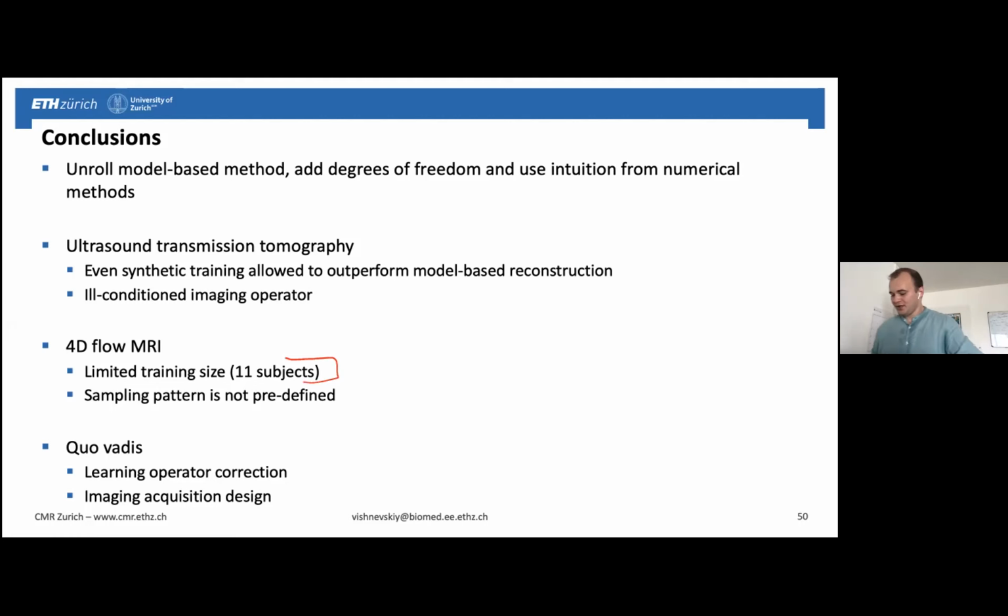And the outlook is that, from my perspective, most of the reconstruction methods are already at the limit of the amount of information that we can extract from the signal. A lot of papers report improvements of 15 or 20% in reconstruction accuracy, but unfortunately, most of those improvements are shown in synthetic experiments. They can change the data, so they divide the test and training datasets. But what is more important here is the synthesis model, so how we simulate the synthetic measurements. And this is what we can overfit to.